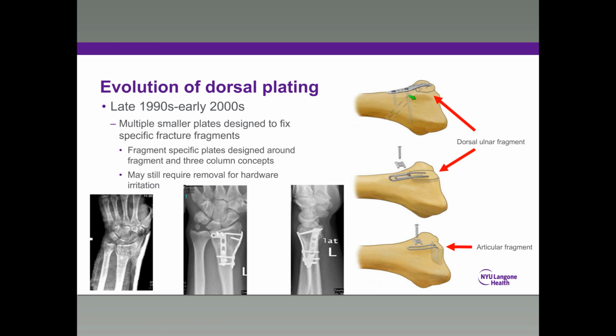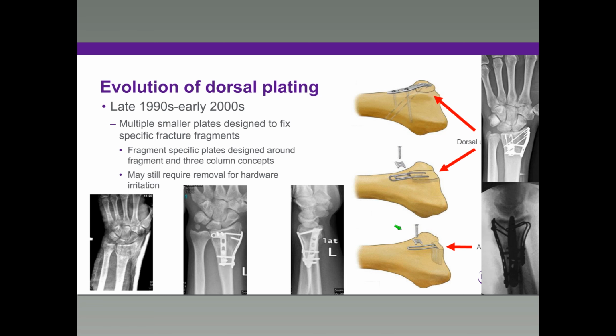There are a lot of different options with these, and here are just a couple. There's a little plate like shown on the x-ray. They have these little things here, which when they first came out we derisively referred to as pins and paper clips. You can take this and put this little thing in your dorsal ulnar fragment as another way to fix that. And you can even put these way up under the articular surface and fix them in with screws.